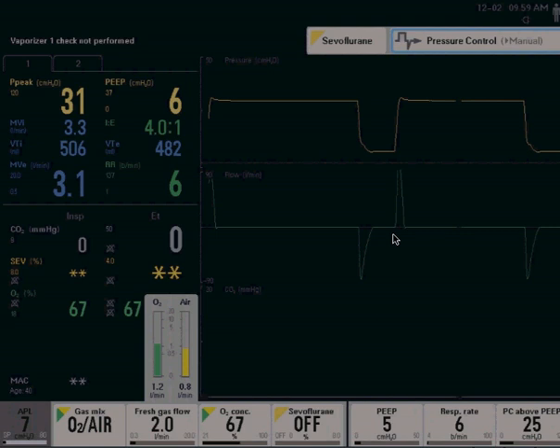So we do have total exhalation. There's no generated auto PEEP at all. And then you manipulate your PEEP to get your exhale tidal volumes in your 4 to 6 range. Now, published in the medical journals, no one way is superior. However, through bench studies and mathematical models, they found that if you allow for complete exhalation, you do not have auto PEEP, and by manipulating your PEEP level, you have more consistent exhale tidal volume. So you don't have large overshoots of exhale tidal volume, and it's more in the lung protective range.